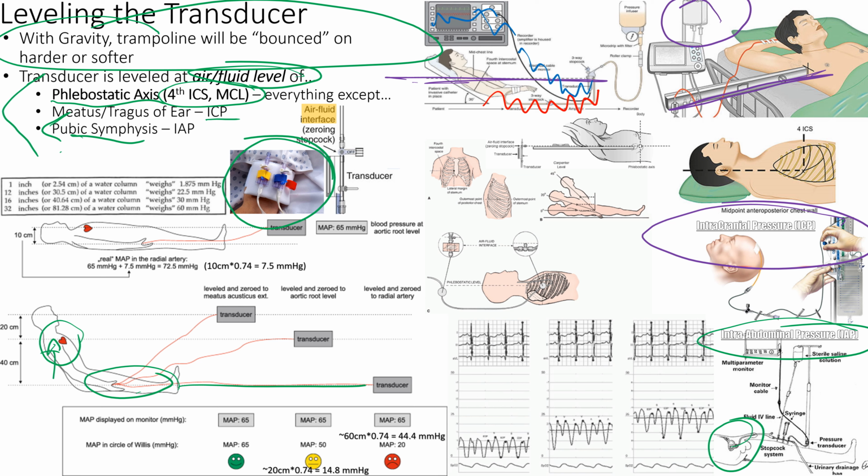And we keep a fluid column pushing the other direction. Otherwise our line is going to get clotted off, right? Because arterial pressure is what? 120 over 80. You've seen 200 over 120. You've maybe seen a 240 over 140, right? So 300 millimeters of mercury, nobody has hit 300 just yet, right? So that's why we have it up to 300. It's not going to go any higher than 300. So we're going to be pushing at least 300 millimeters of mercury into the patient.